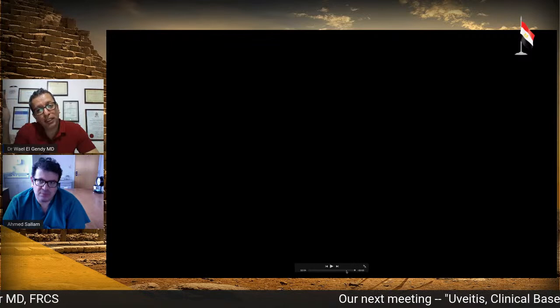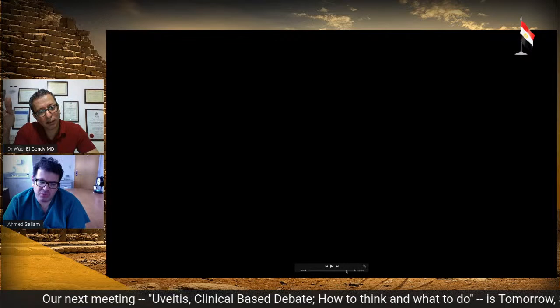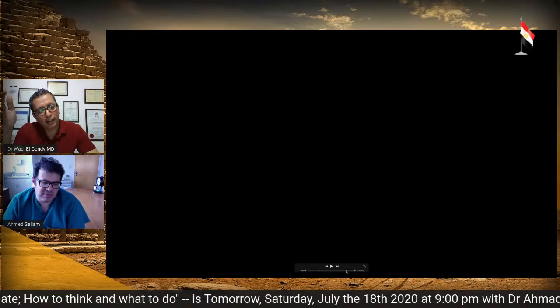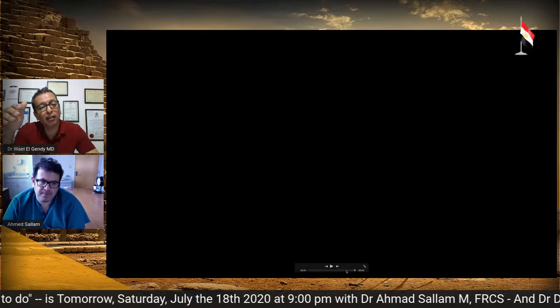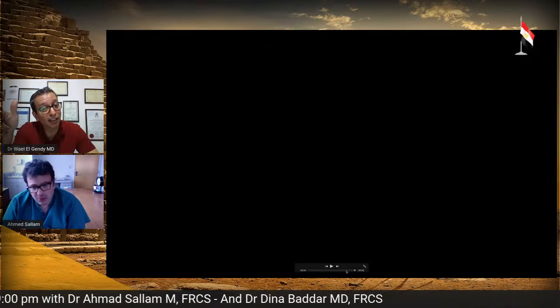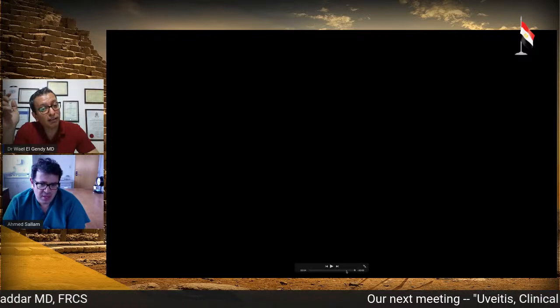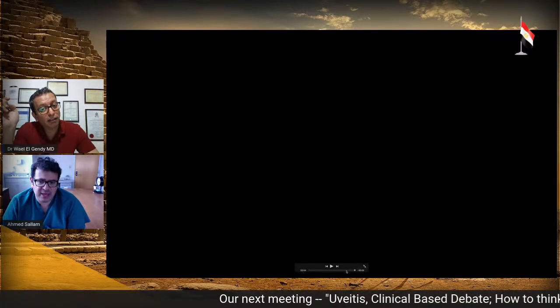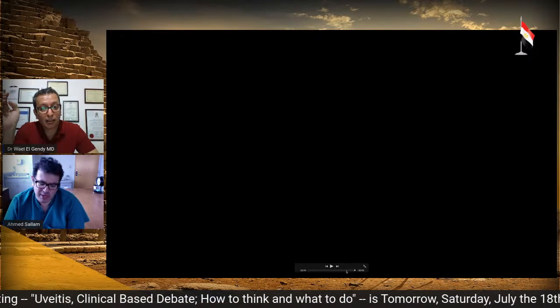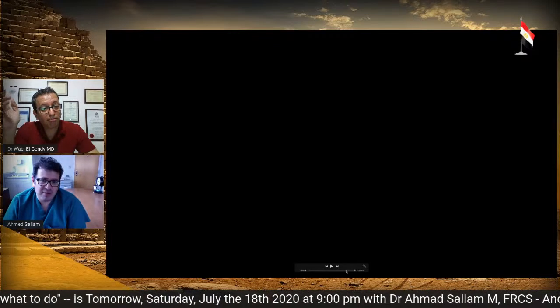Okay, so if you leave the PFCL, you leave it for 1 week? Yeah, I leave it for 7 to 10 days maximum, and then I take it out. And I may leave nothing or leave air. You may leave it on fluid, or air, or gas? No, fluid or air. Usually it's stuck down. After a few days, if the laser kicks in, then it's really stuck down. And I feel it's a nice way. You have a look, you revise your work, maybe add a little bit more laser, admire your work, and then just leave it on air.